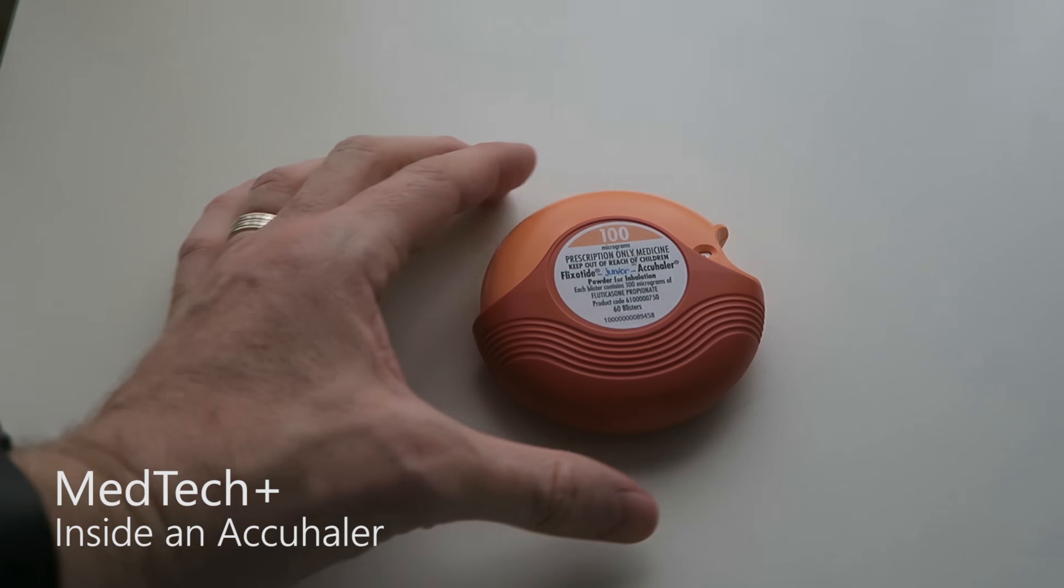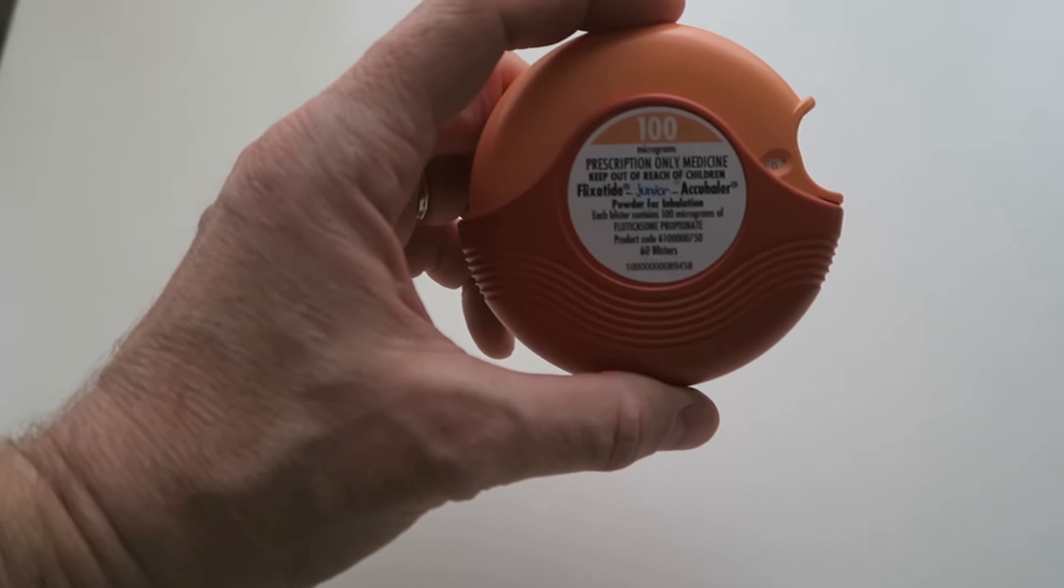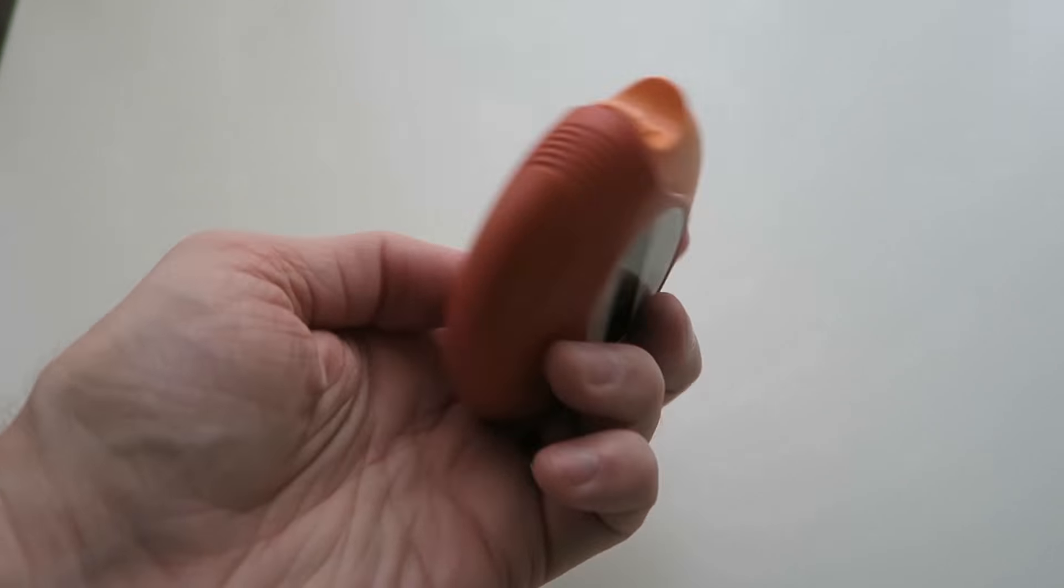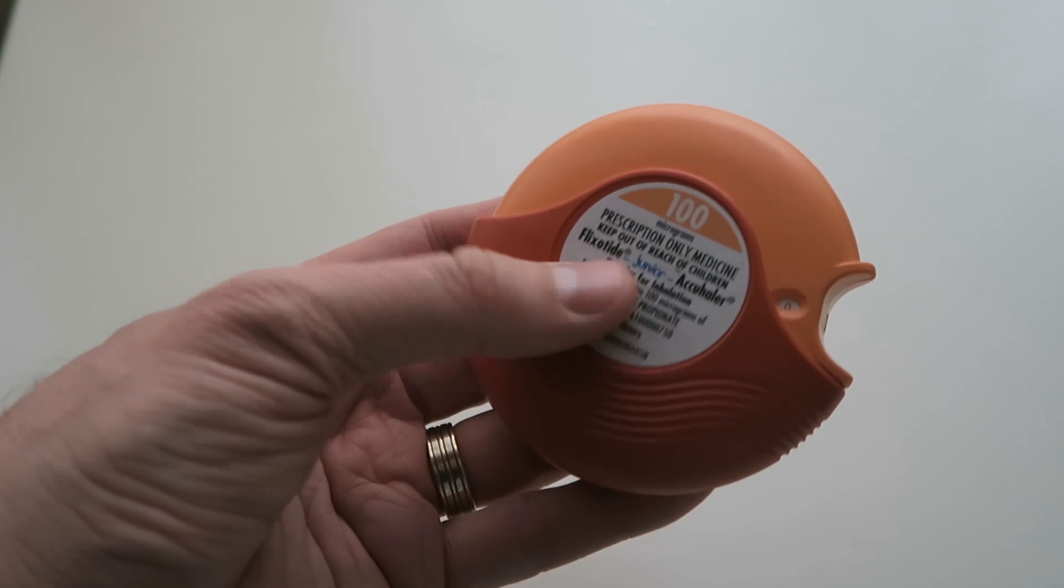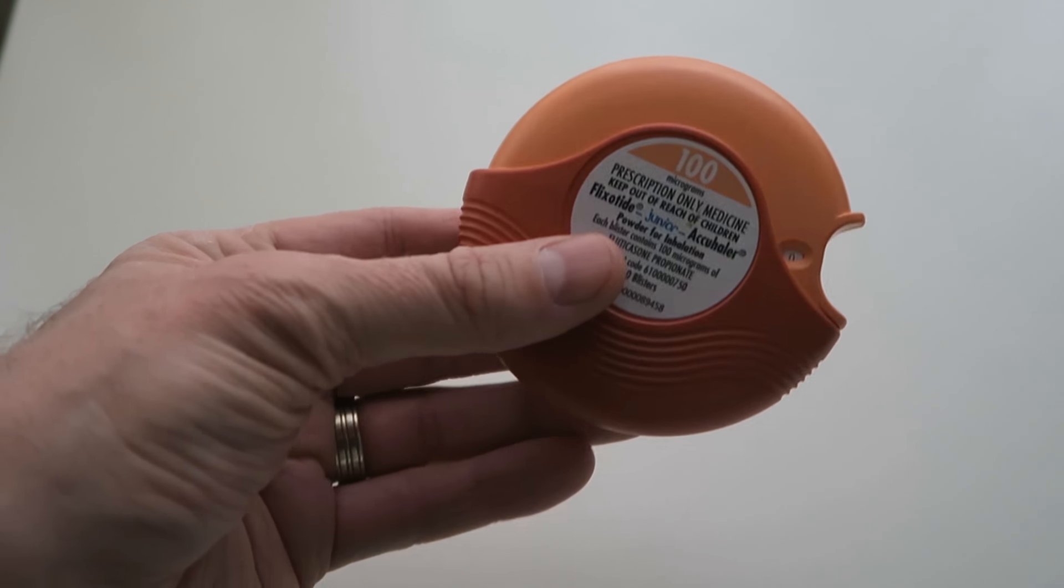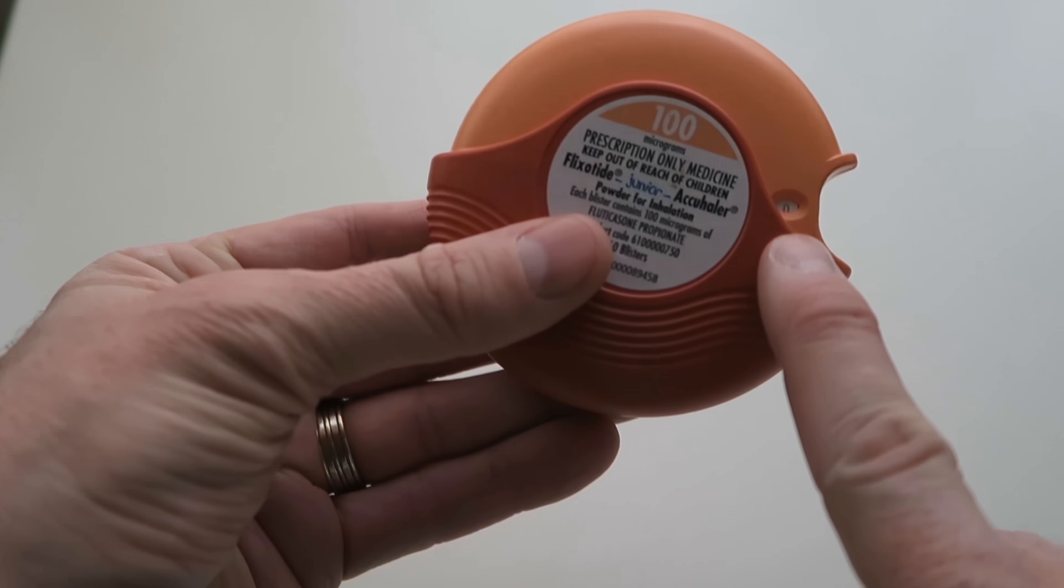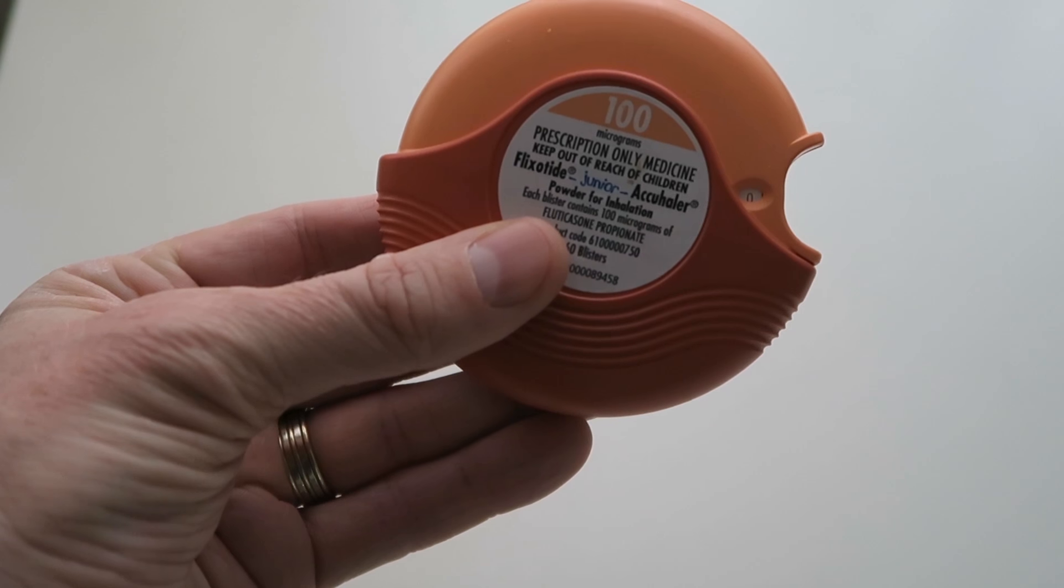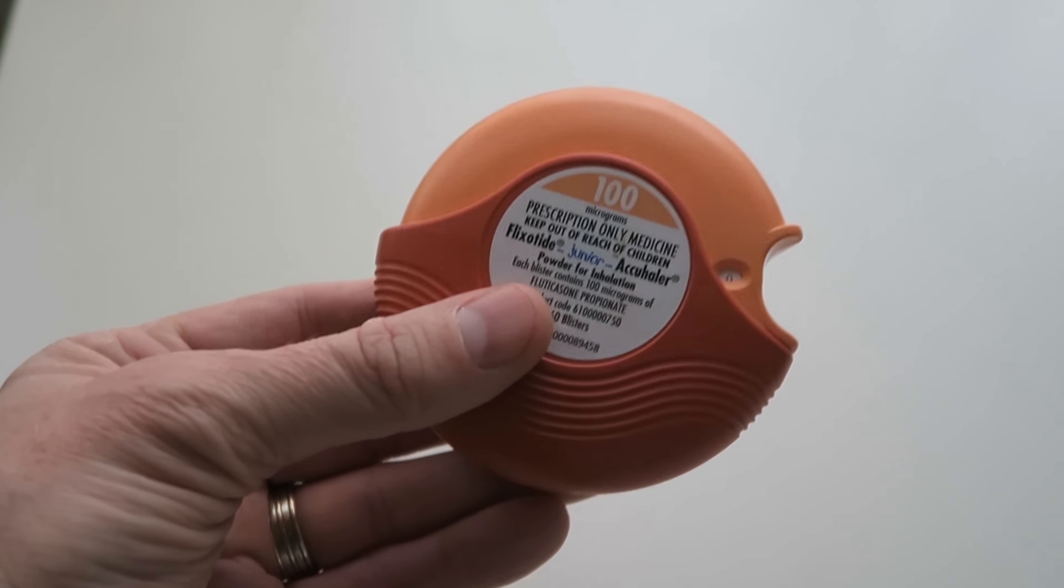In this video we're going to be looking at the inside of the AccuHaler. Now this one is a junior, but we're not looking at so much the medicine but the actual delivery device itself, this little disc. As you can see here, the little number zero in the window indicates that the medication is fully used up.